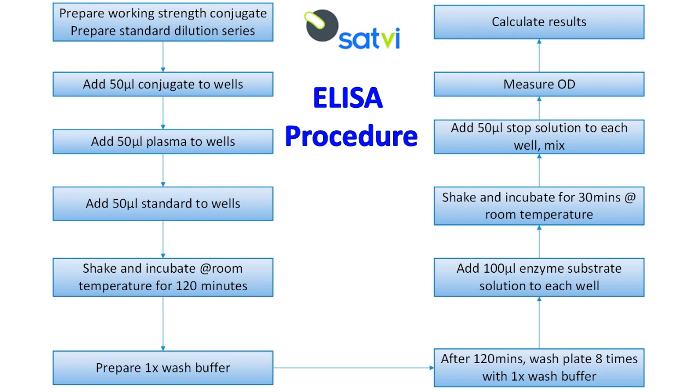Incubate the plate at room temperature for 120 minutes. Wash the plate at least 8 times with the prepared wash buffer after incubation. Add 100 microliters enzyme substrate solution to the plate. Incubate the plate for 30 minutes at room temperature. Finally, add 50 microliters stop solution to the plate.